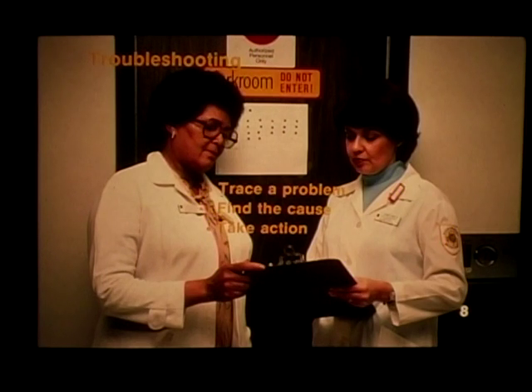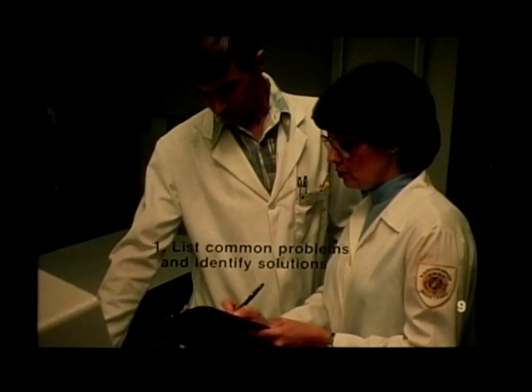Number 8. In addition to making adjustments in the darkroom and on the processor, radiographers can save the department costly service calls if they have a thorough understanding of how their radiographic equipment operates. Troubleshooting is a process of tracing a problem, finding the cause, and taking appropriate action. A troubleshooting program can be used to handle problems with radiographic equipment. If successful, a troubleshooting program will eliminate unnecessary service calls.